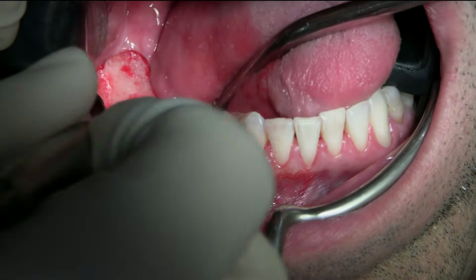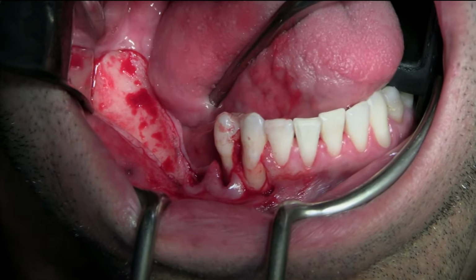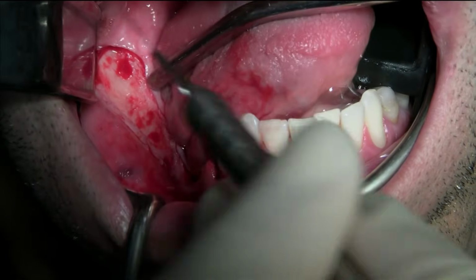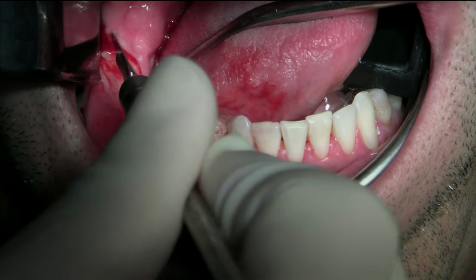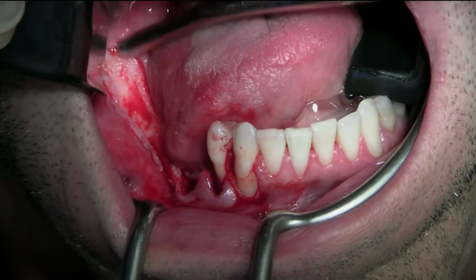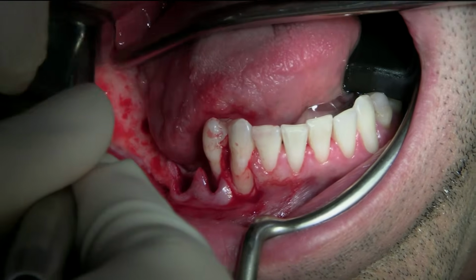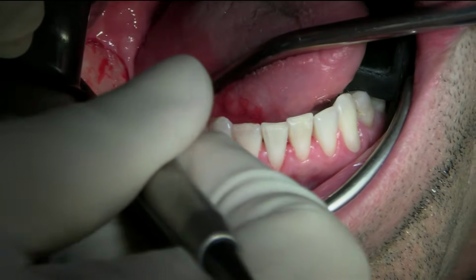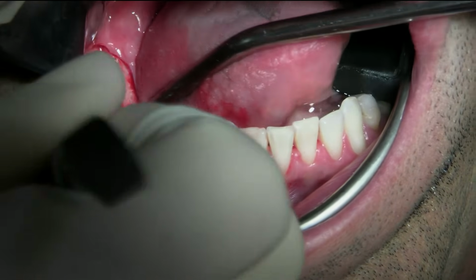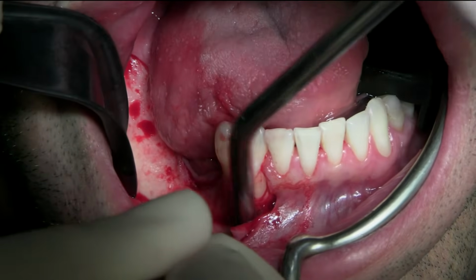So now I have full thickness all the way to the ramus. Let me have a 15 again. I'm going to make the incision a little bit longer distal so we can harvest the necessary bone. Always careful here with the, yep.